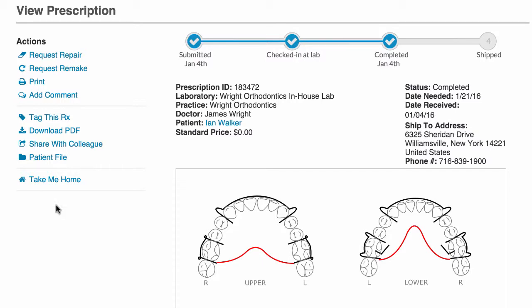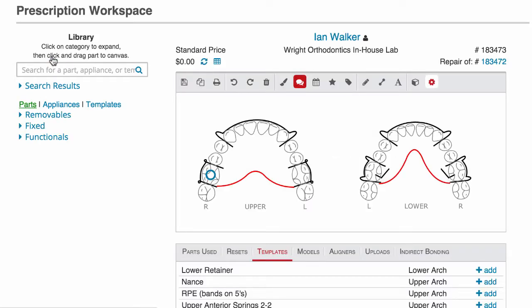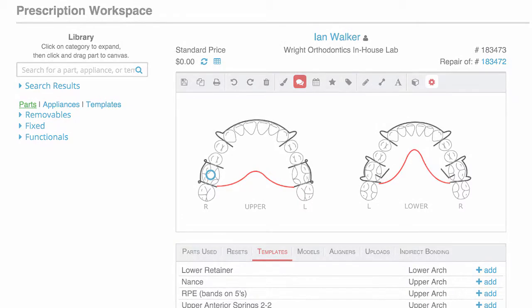Easily and efficiently manage repairs and remakes. So if little Johnny returns with his broken retainer, simply view his prescription and click the repair or remake option in the actions menu. EasyRx will populate the original prescription, and you can edit if needed. In just a few seconds, the repair or remake is ready to go for the in-house lab.